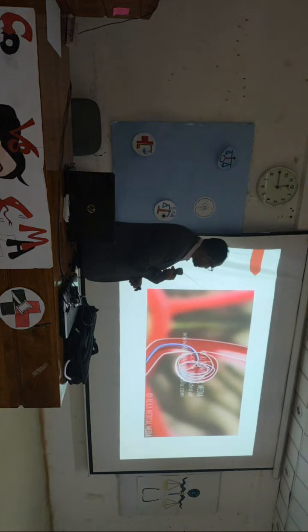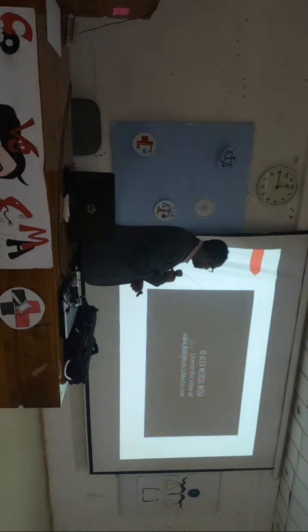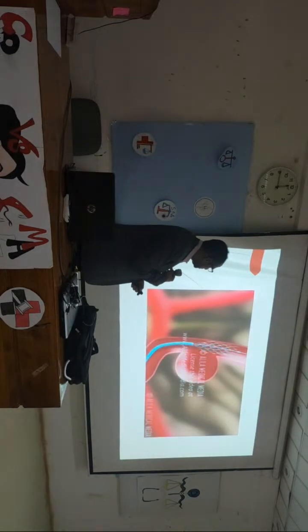It will take several coils to fill the aneurysm. The coils induce blood clotting inside the aneurysm and seal it off from the artery. In some cases, in the event that the aneurysm is too wide, a stent can be used to keep the coils within the aneurysm sac. Stent-assisted coiling involves permanently placing a stent in the artery prior to coiling. The stent acts as a scaffold inside the artery to hold the coils in place.